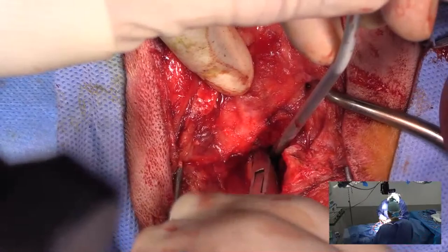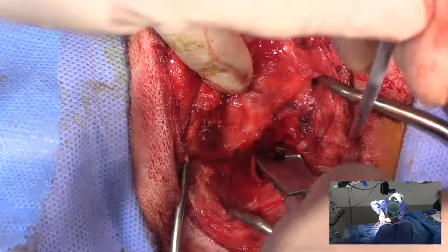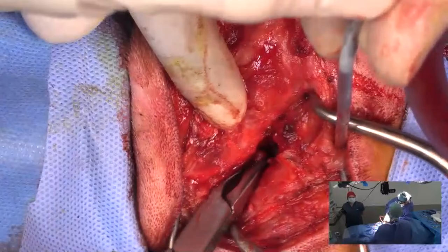So when you're going through a previous surgery site, it's always tricky because the anatomy is going to be disrupted and it's harder to find landmarks to allow you to protect the facial nerve. We were lucky here that we were able to protect it well. But it certainly adds an extra layer of difficulty to the procedure.